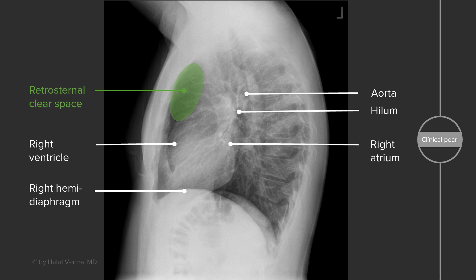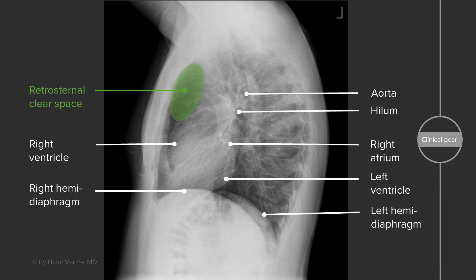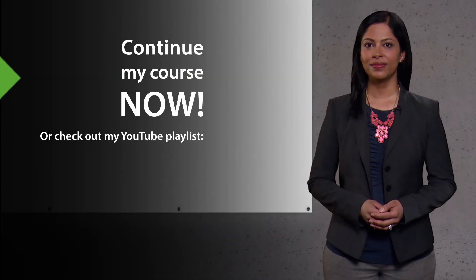Here you can see a portion of the right atrium forming the posterior heart border. The superior aspect of the posterior heart border is the right atrium, while the inferior aspect of the posterior heart border is the left ventricle. And posteriorly here, slightly lower than the right hemidiaphragm, is the shadow of the left hemidiaphragm.